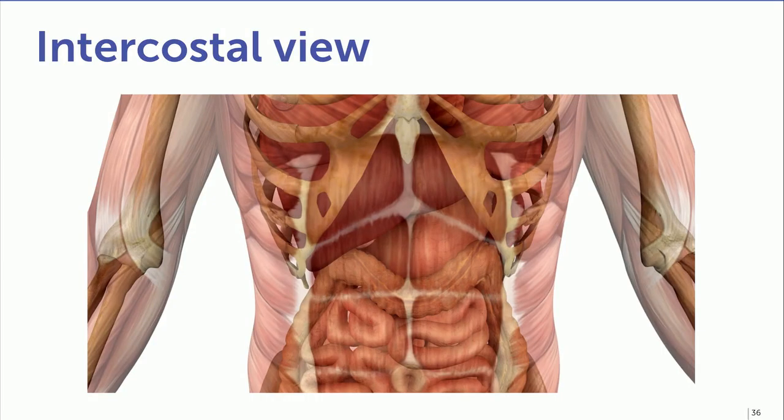It's the intercostal view. We place the transducer in between the ribs on the lateral thorax, in the intercostal space, and get this view. So we can see liver parenchyma, the IVC, portal vein, and in this view also the gallbladder. And I think we can see the bile duct over here. Common bile duct, correct. So that's the best view. But that's a video, everything in one view. Okay, thank you. It's even perfect, the portal vein, beautiful.